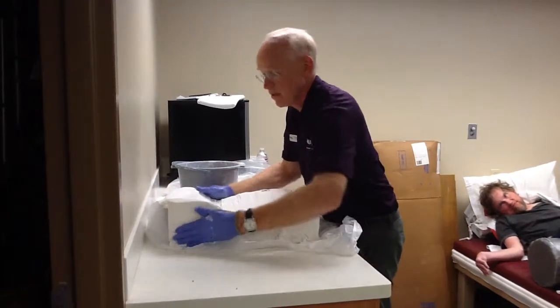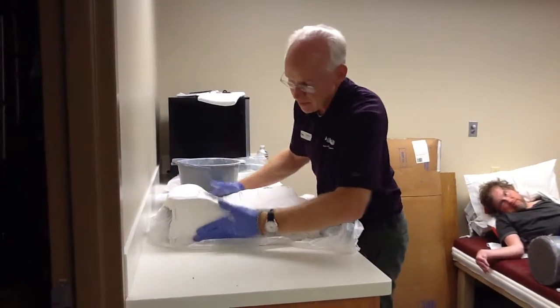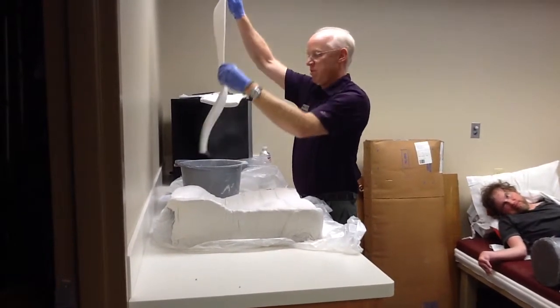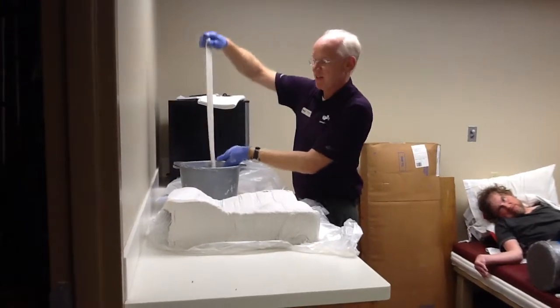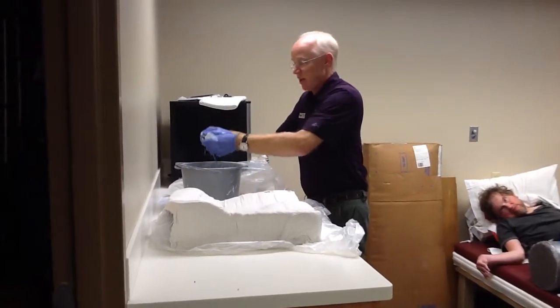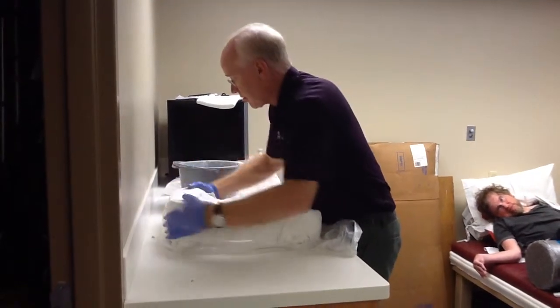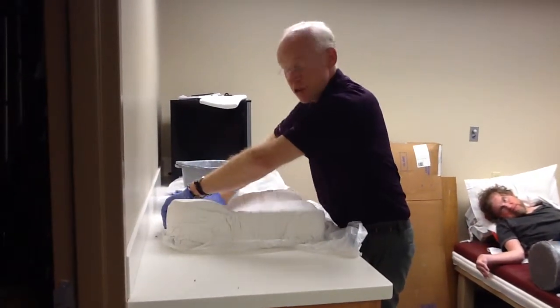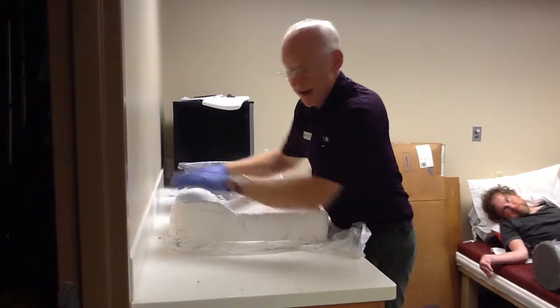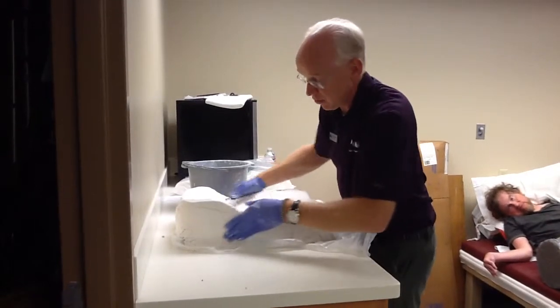I'm almost done. It seems like a long time when you're just filming it, but this has taken me less time than it would take to try to do a complete new shape capture — and this is likely going to achieve a much better outcome. I want to make sure there's no hammocking of that plaster cast across my offloading contours. If I have any hammocking of the cast across those areas, I'm obviously going to be diminishing the offloading of the duplicate cushion.